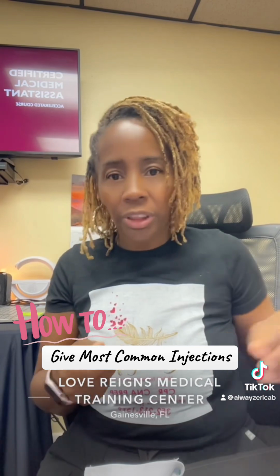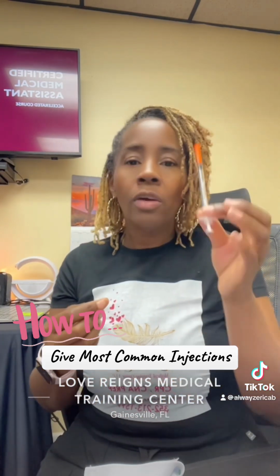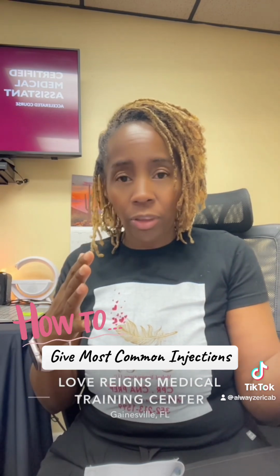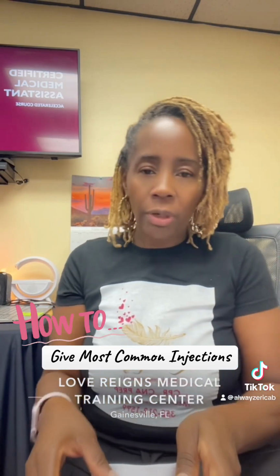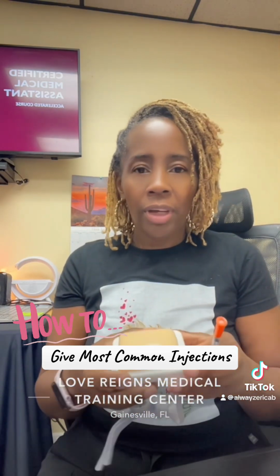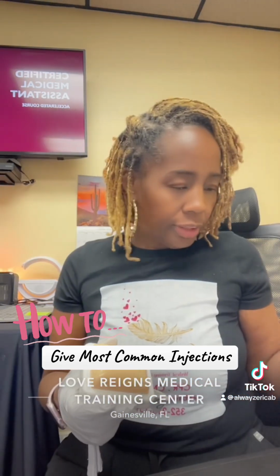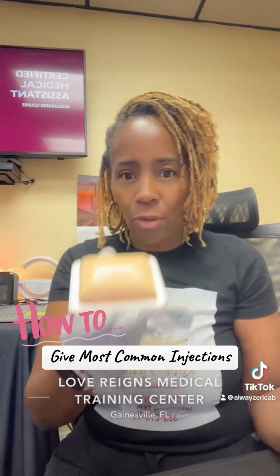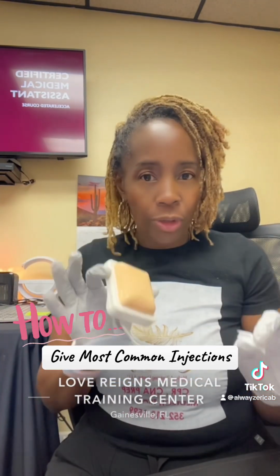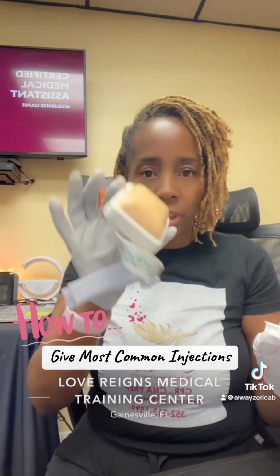It's still a puncture resistant container, that we want to make sure that when we put this in there nobody will get stuck, you know, messing around with it, okay? So for the most part, after this is air dried at least 30 seconds, you want to... Because I did not have on my gloves before, and some people get confused, I want you to know that if you were doing this on a patient, you would be doing this with gloves on.